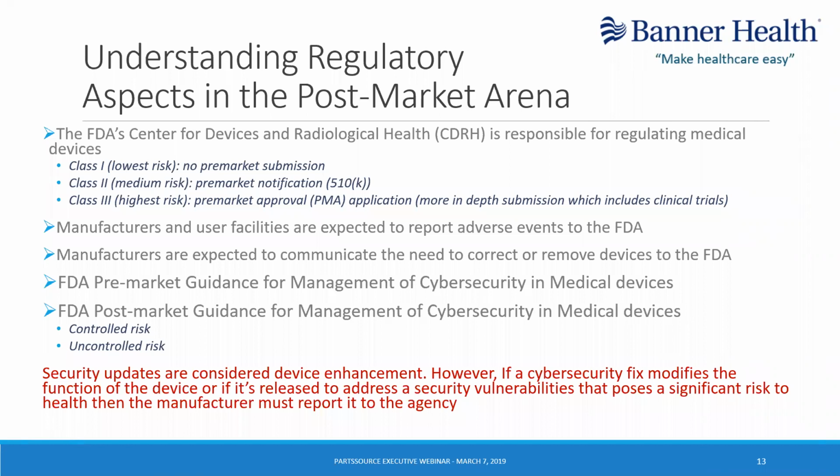What I think is, though we have the language to report adverse events, we aren't doing a good job with reporting events related to the cybersecurity of the clinical systems. If you look at the MAUDE database and try to extract events reported around cybersecurity, you really find close to none. However, FDA has supported these efforts tremendously. They've addressed concerns of the clinical systems and what kind of risk they present through their safety communications. I'm not sure how many of you have actually read through those. They work with the manufacturers and the researchers to identify risks, exploitable vulnerabilities, and ways to address them. This information is then relayed to the users through their safety communications.